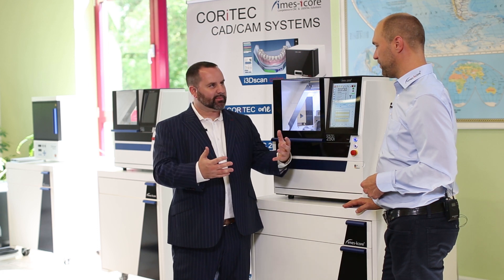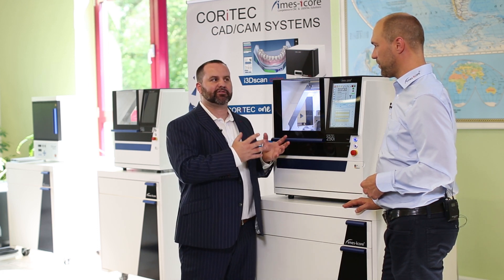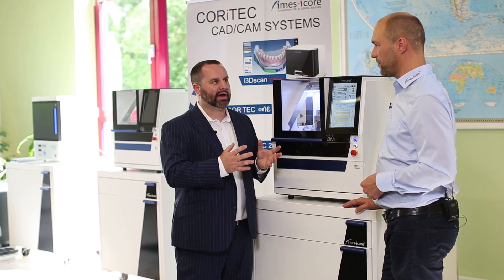There are other competitors on the market in the same price range. What makes the 250i the better buy? We offer wet and dry in one machine. A lot of competitors offer just one machine for dry milling and a separate machine for wet milling.